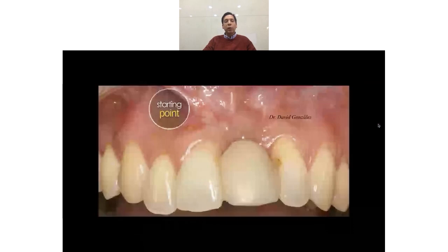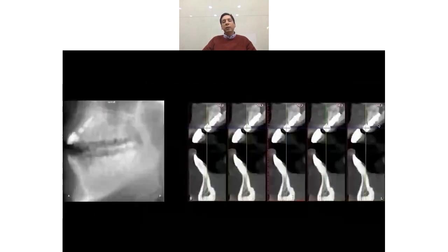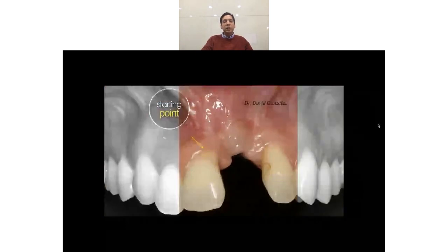And now we will take a closer view. This is the CBCT, where we can see that the implant is invading the incisor canal. It's totally inclined. And after removing the Maryland that she had, we can see that she has not only a bone defect, but also a soft tissue defect, which makes the case even more difficult.